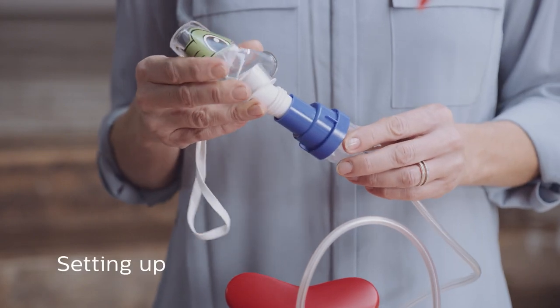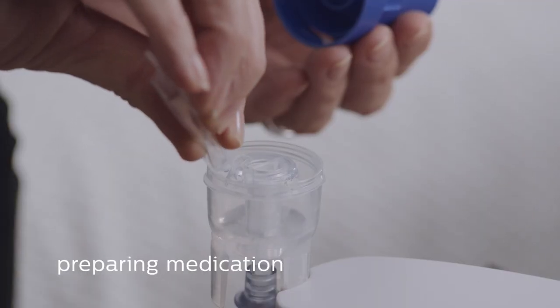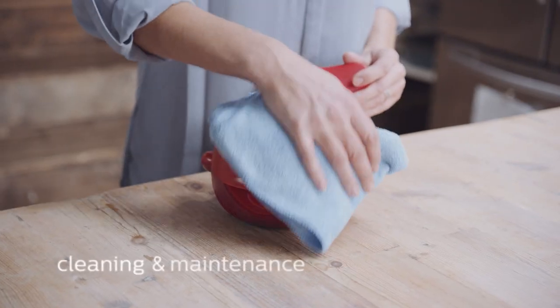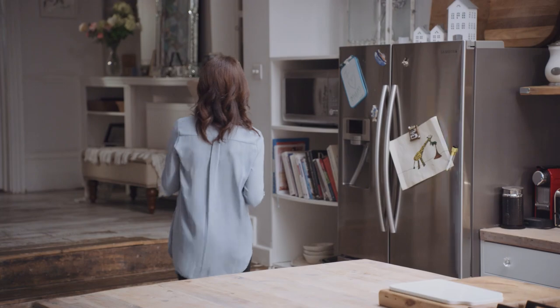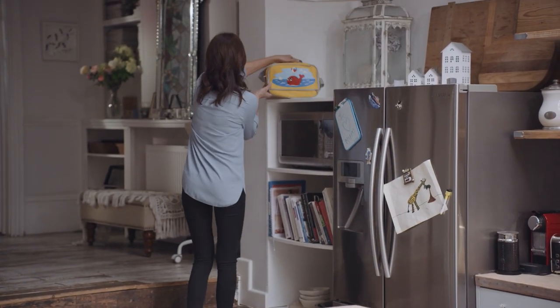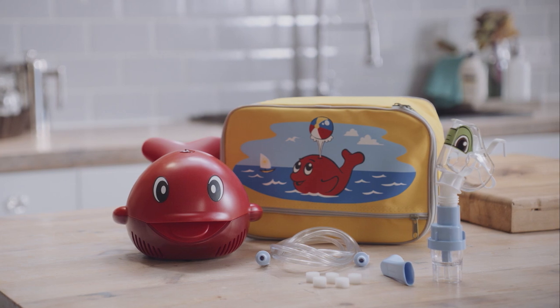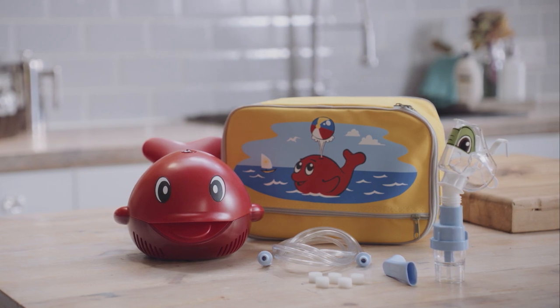This includes setting up the Sidestream nebuliser, preparing the medication, taking a treatment, cleaning and maintenance of the product, checking and replacing the filter, as well as storage between uses. It's important to carefully read the instructions for use before you use the Philips Willis the Whale for the first time.